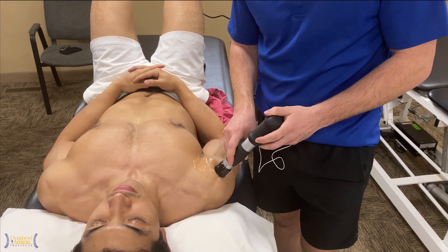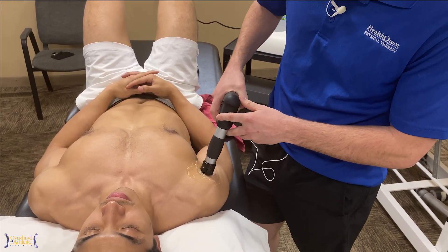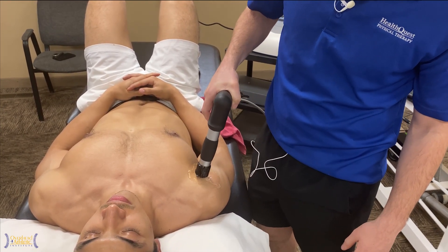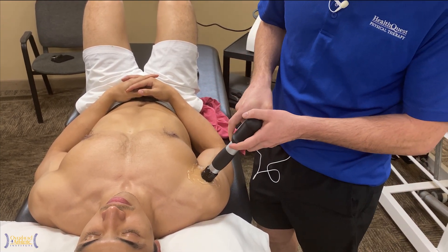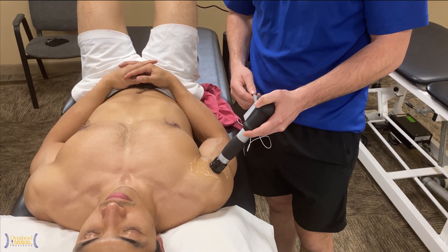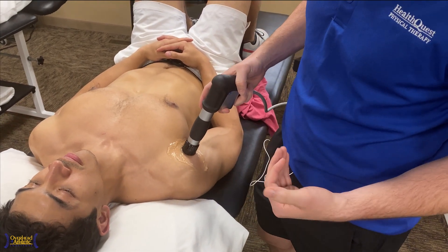Working on shockwave here on the anterior shoulder down the biceps tendon can decrease pain for our athletes and allow the athlete to get back to sport a bit quicker. High-energy acoustic waves delivered into the anterior capsule decrease pain, stimulate some healing, and actually improve the proliferation of high-quality collagen, not immature quality collagen.